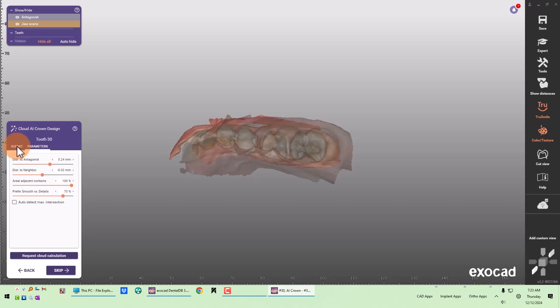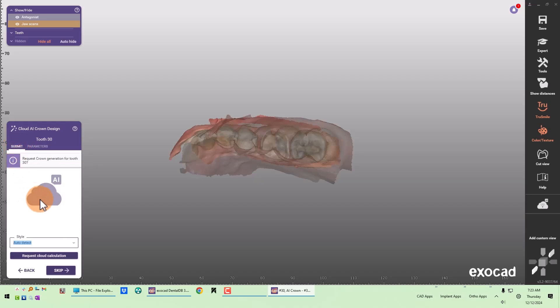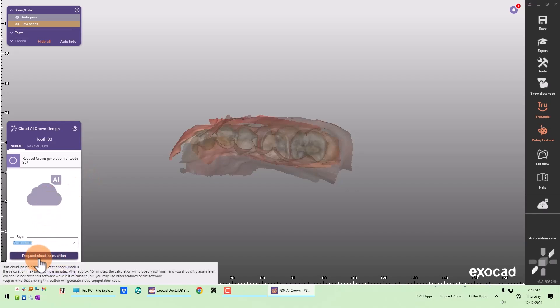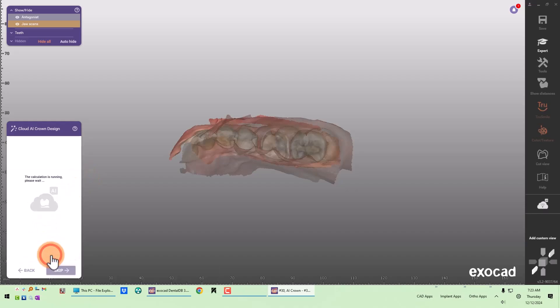I'll do another video to show how you can preset those parameters using the work parameters configuration tool. But once you have those settings configured for your specific mill or milling center, you don't ever have to change them. So when you get to this cloud AI crown design portion, all you really need to do is click Request Cloud Calculation.